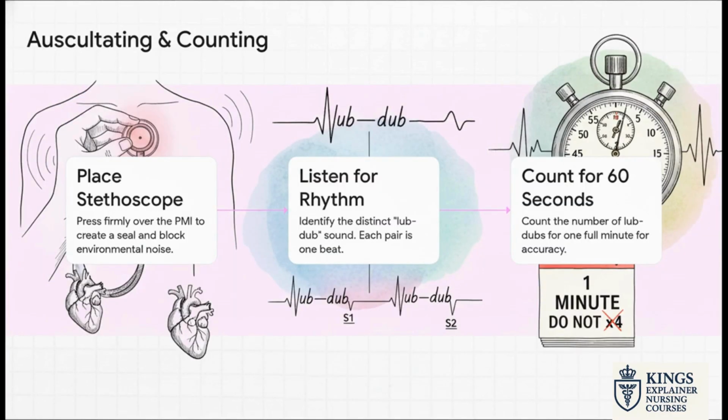Now, for the main event, place your stethoscope firmly over that PMI. You want a really good seal to block out any extra room noise. Listen for that classic lub-dub. That whole sound is just one beat.